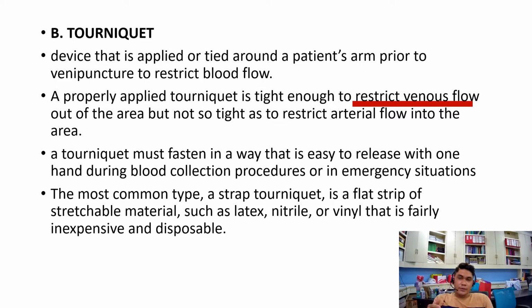In that way, it's easy for the phlebotomist to palpate and locate the vein, and since the blood vessel is inflated, the wall of that blood vessel is thinner, so it's easy to pierce using a needle. So that's the purpose of your tourniquet application.